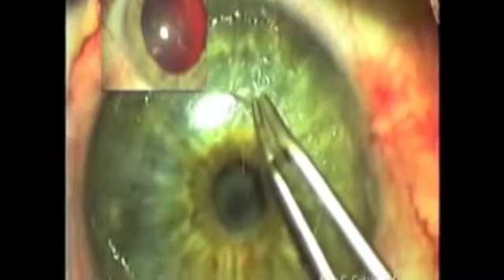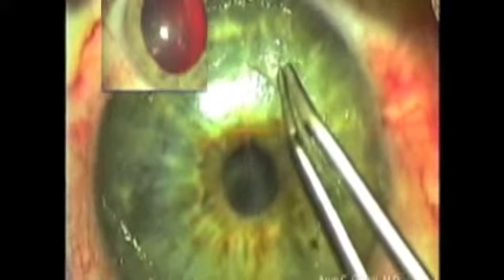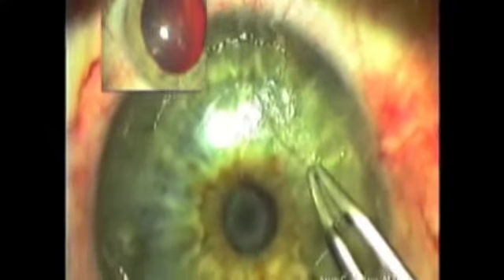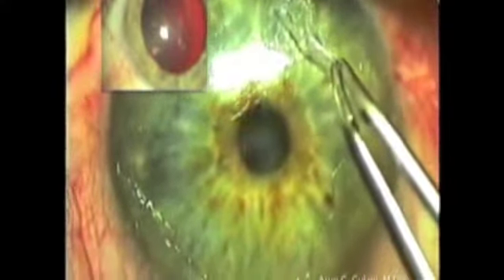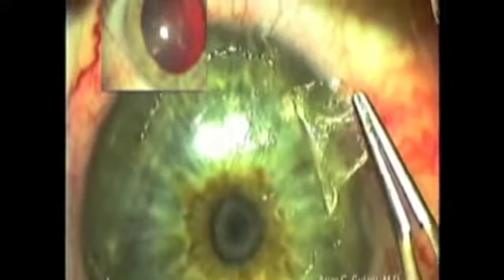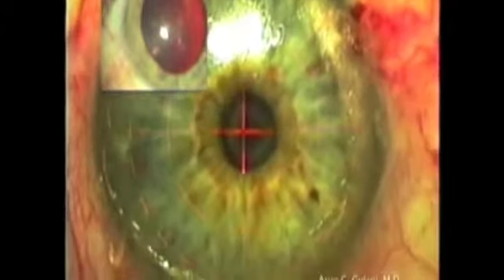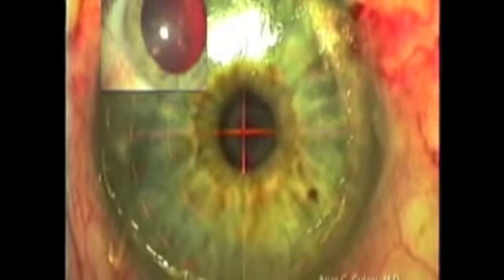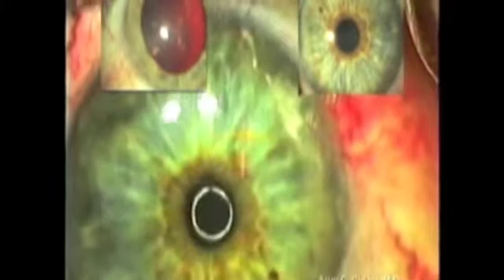In deeper on-corneal scars like these, they can also be peeled off using patience and a resistance-guided technique again to gently peel them off the rest of the cornea. Once again, try and maintain the entire piece as a single removal technique. Once it clears the visual axis, you can proceed with the refractive laser PRK ablation as seen here. Mitomycin C application. Complete central clarity to an excellent outcome.